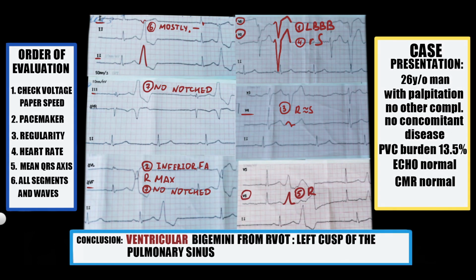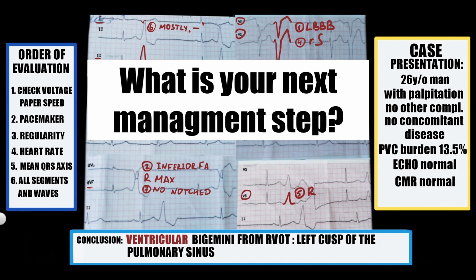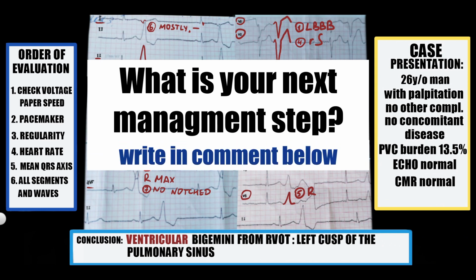And the final question: what is your next management step and how does the PVC site of origin define the strategy? Write your thoughts in the comments below.